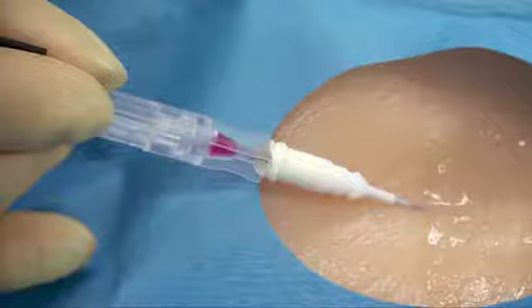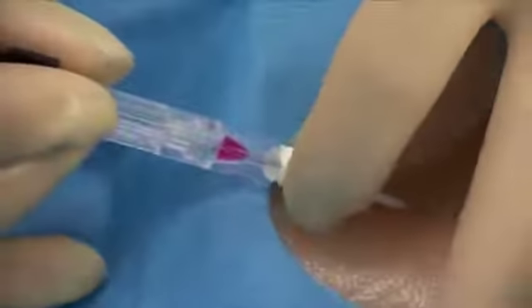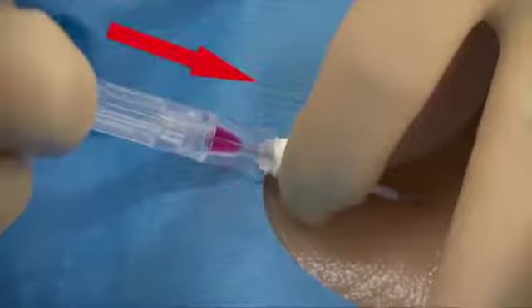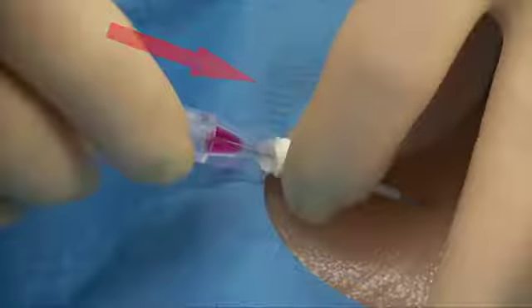Lower the placement device assembly slightly. Stabilize the position of the introducer needle and carefully attempt to advance the spring wire guide into the vessel using the spring wire guide handle. When the spring wire guide handle reaches the black line on the tube, this indicates that the tip of the spring wire guide is located at needle tip. Note, if resistance is encountered during spring wire guide advancement, withdraw the entire unit and attempt a new puncture.